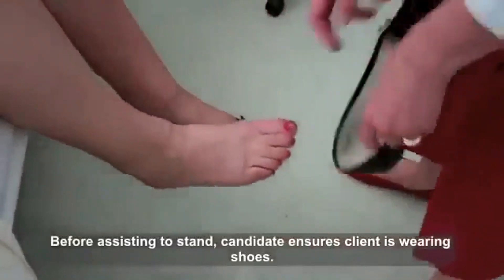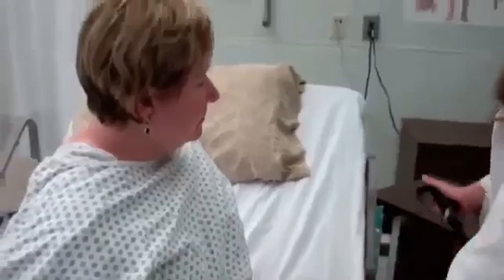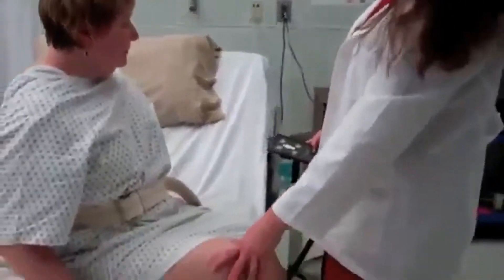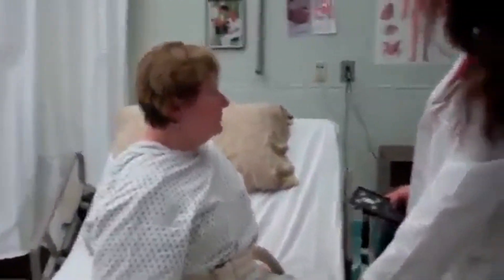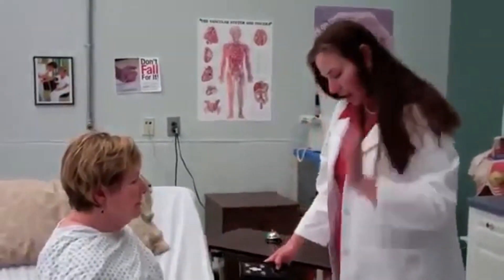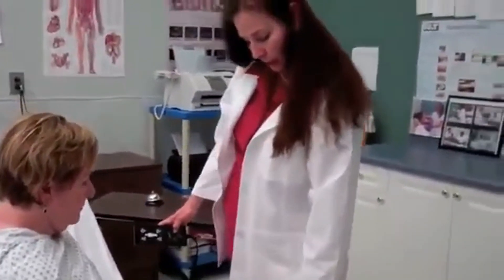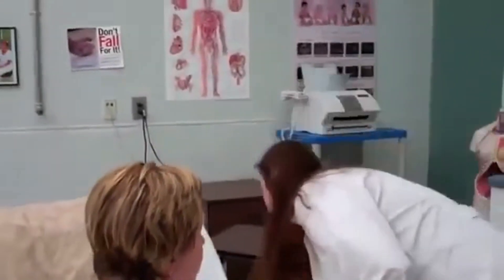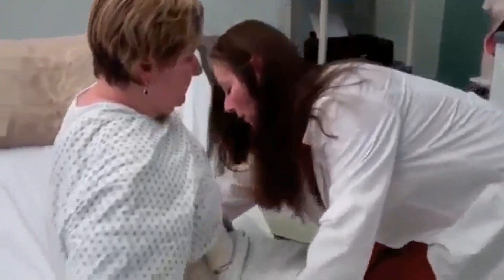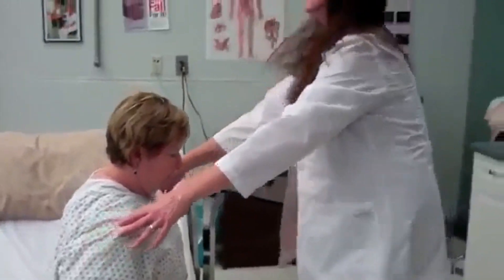Let's make sure you have your non-skid footwear on. Now what I am going to do is put the bed down so your feet can get flat on the floor before standing. Now, if you don't mind, I want to go ahead and put my leg — your leg, my leg, your leg, my leg — okay? So you need to move a little closer to the edge, and your feet are flat.